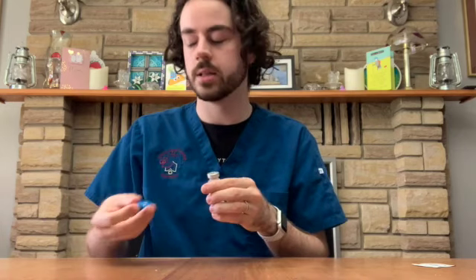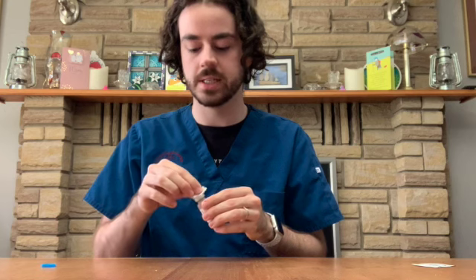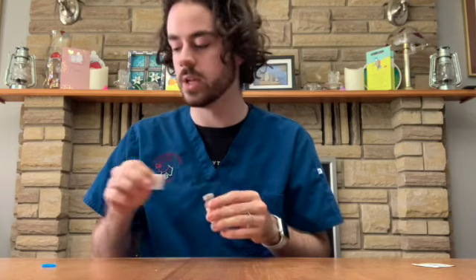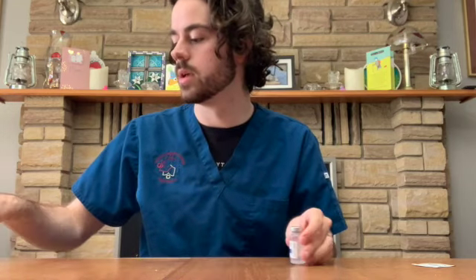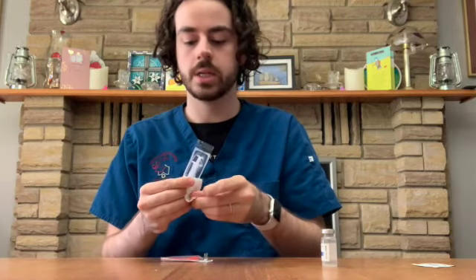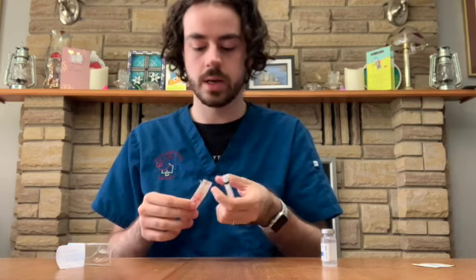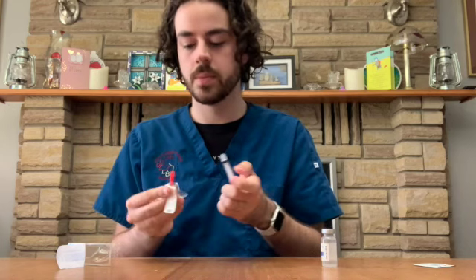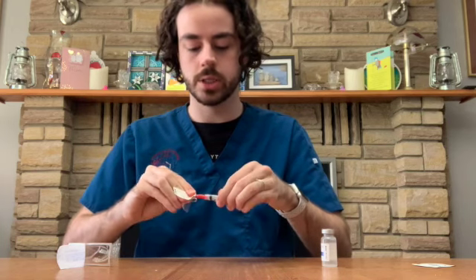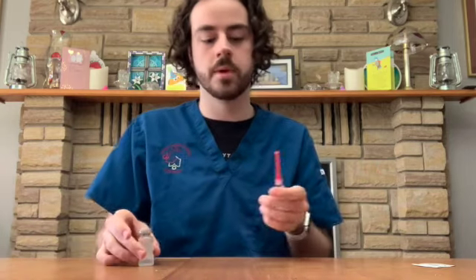I'm going to take the top off of this and cleanse it with an alcohol swab, scrubbing it for 15 seconds. I won't do a full 15 seconds just for the video. And then to get my supplies ready, I'm going to take my syringe out. This end right here is sterile, so I'm going to be careful not to touch it. Open up my blunt needle, this end is sterile as well. And then the two can just attach like that. And then I'm ready to draw up my medication.